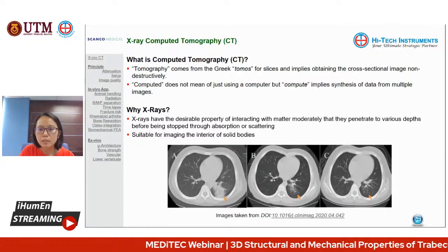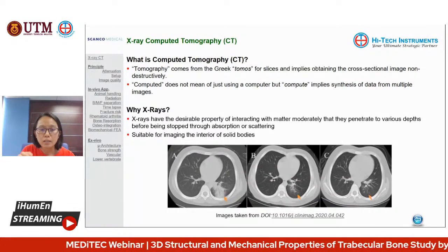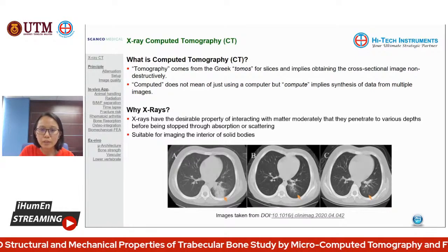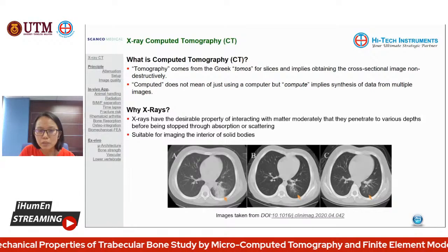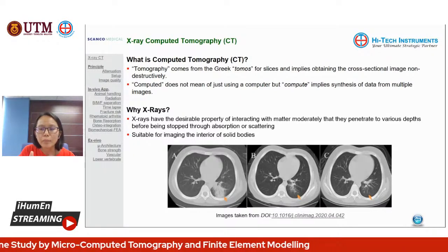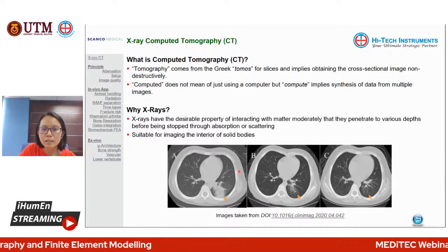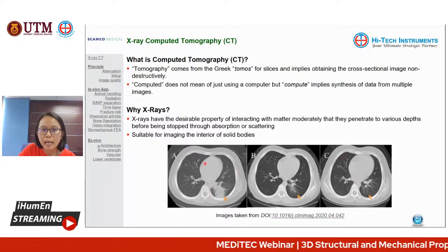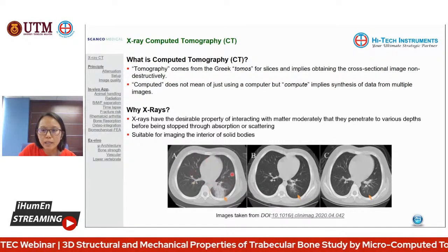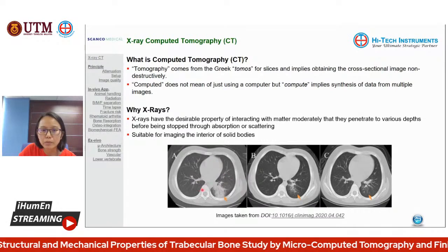So here I've got these CT images. I believe some of you might have seen similar images. It's a 7-year-old female patient with COVID. You can see here the axial CT images, and from here you can see the consolidation in this part, the lung lobe here, with a higher density and a blurred boundary.